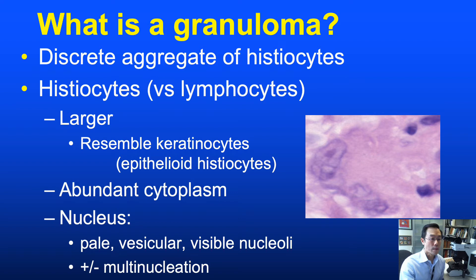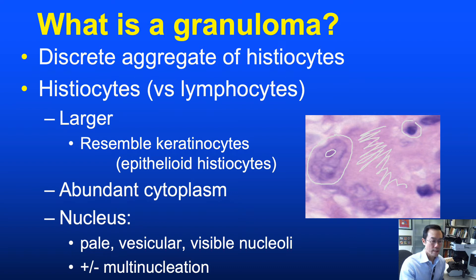Compared to lymphocytes — relatively small, with round hyperchromatic nuclei and scant cytoplasm — histiocytes are much larger, sometimes quite large and resembling keratinocytes. When histiocytes form granulomas, the term 'epithelioid histiocyte' is often used, reflecting their relatively abundant cytoplasm and large, pale or vesicular nucleus, often with a visible nucleolus. Another characteristic of histiocytes in granulomatous inflammation is multi-nucleation — two, three, or even dozens of nuclei within a multinucleated histiocyte.